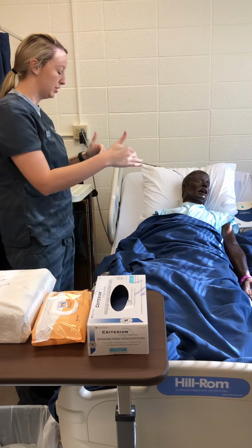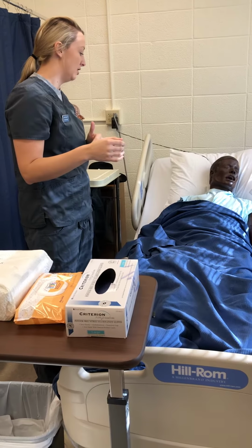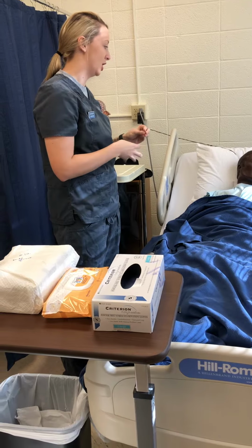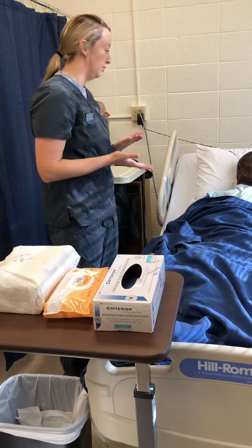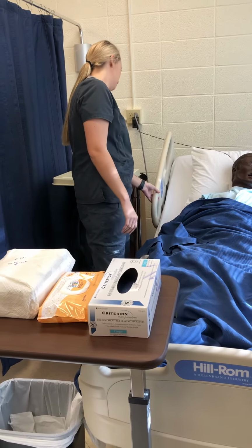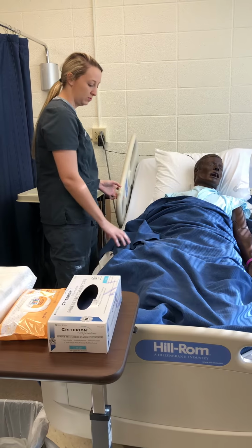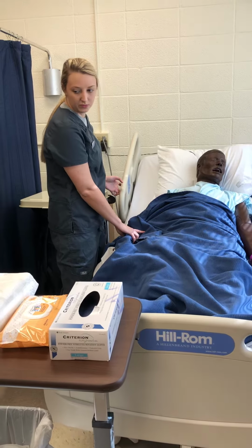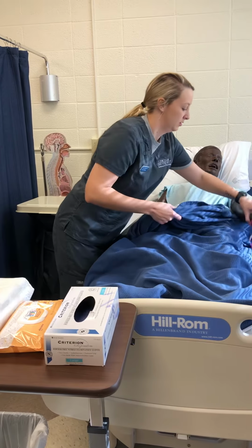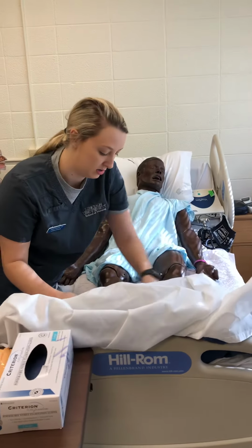I'm just going to have you put your legs up in a frog-like position, and then I'll take a small catheter and insert it into your urethra, and it'll go into your bladder and help drain it. And then this will be removed after you have your baby. So I'm just going to raise your bed. Uncover you. I'm going to walk you through the whole procedure as I'm doing it.